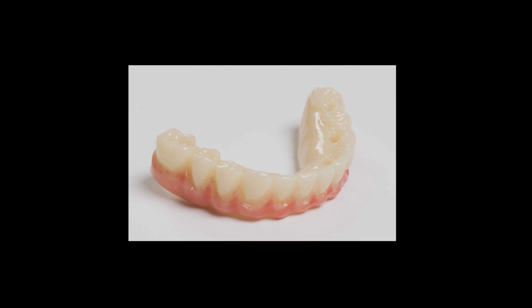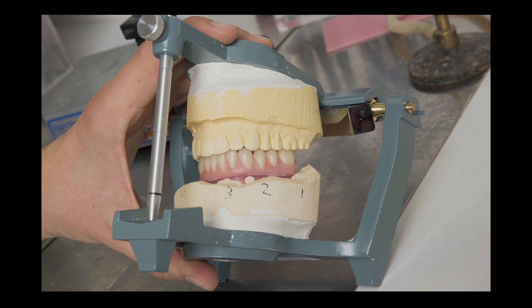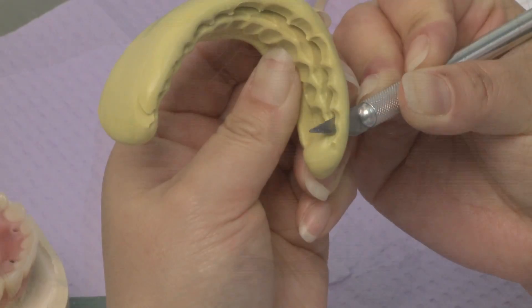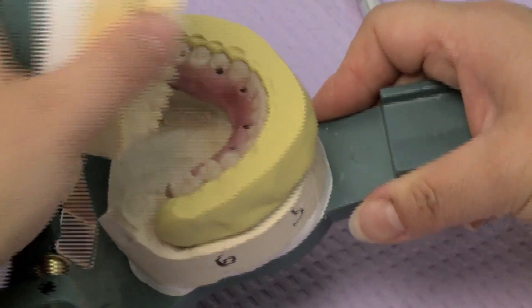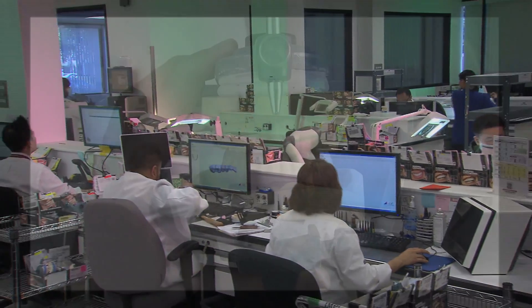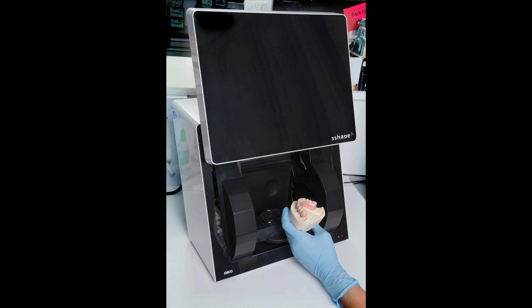Once the wax setup has been approved and the final impression containing the implant verification jig has been taken, the master cast is poured and the provisional CAD-CAM implant prosthesis is fabricated. The lab pours the master model as a guide to confirm that the definitive prosthesis is accurately aligned with the implants. The wax setup is then attached to the model and mounted on the articulator. An index putty matrix is fabricated, which will later be used to verify that the tooth positioning and incisal edges of the approved wax setup are replicated in the final prosthesis. Next, a series of scans is taken to produce an accurate digital depiction of the model and approved setup. Scans are taken of the approved wax setup on the model, the model with scanning abutments in place, and the model with soft tissue only.